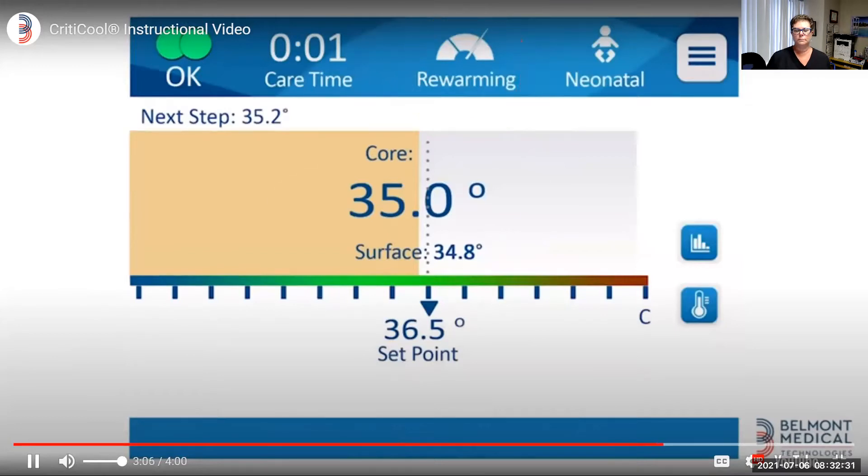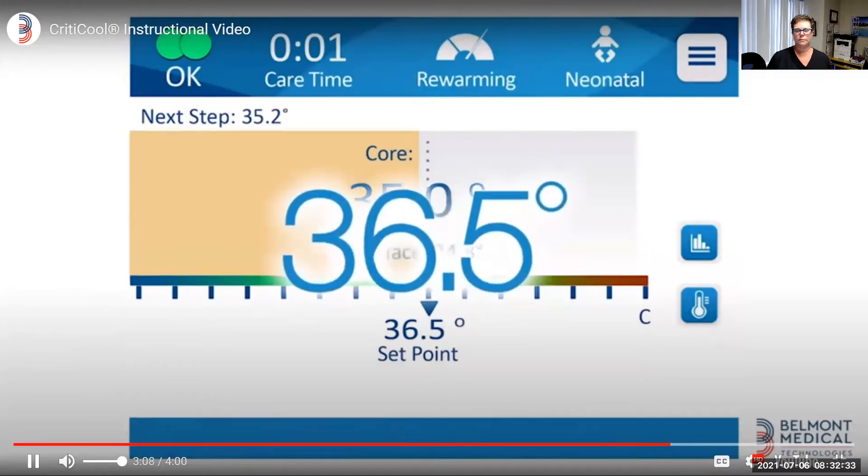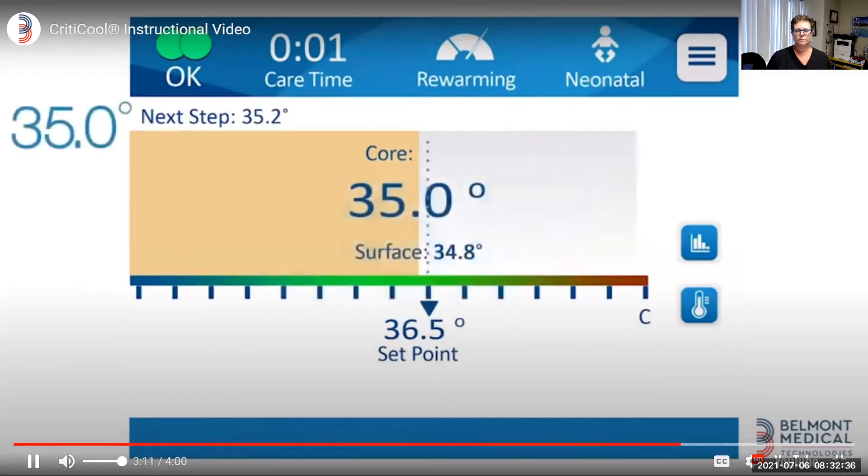The pre-programmed target temperature is 36.5 degrees Celsius in a stepwise fashion of 0.2 degrees Celsius per one hour. Those settings can be changed per the clinician's discretion. The system will reach the desired temperature and maintain it until the treatment is complete.